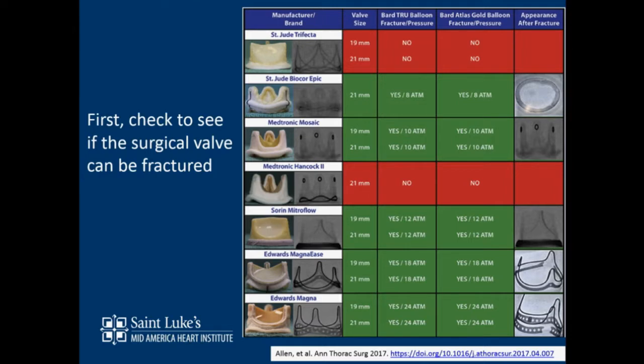And about the mitral position, I had a colleague from Greece call me in the summer. He had the same question about the mitral valve. He asked if he can break the ring in a patient with bioprosthesis failure and previous known mismatch. He was asking how unstable it would get and how he would be able to mount a CoreValve in the mitral position after he breaks the ring. My understanding is that he never broke the ring, and he undersized; the valve finally was undersized, and the patient didn't do too well.